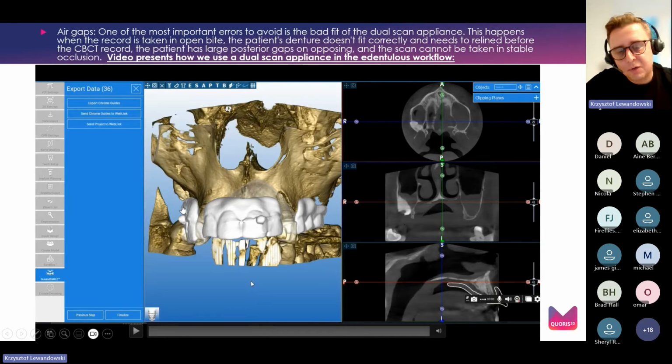I've prepared for you a video where I would like to explain why it's very critical to avoid the air gaps.